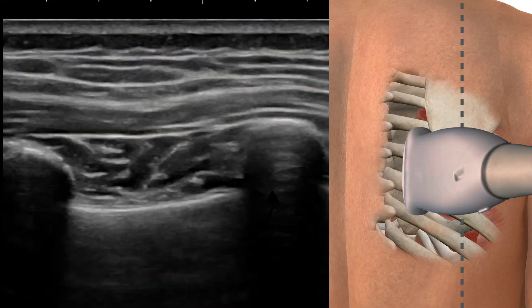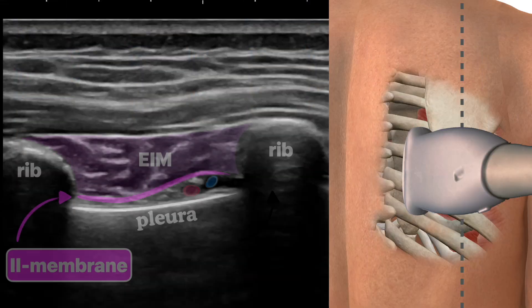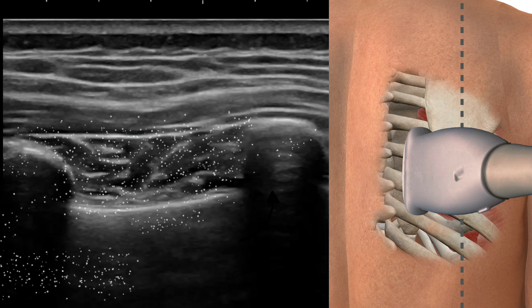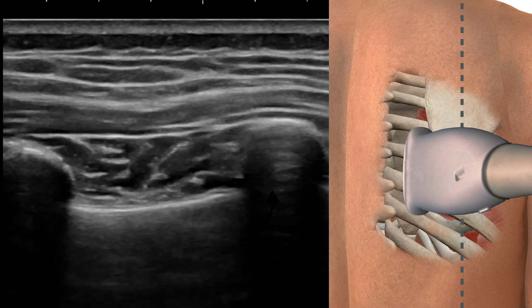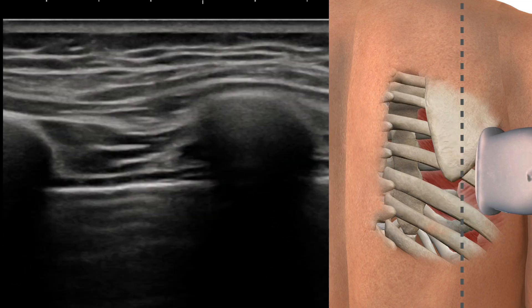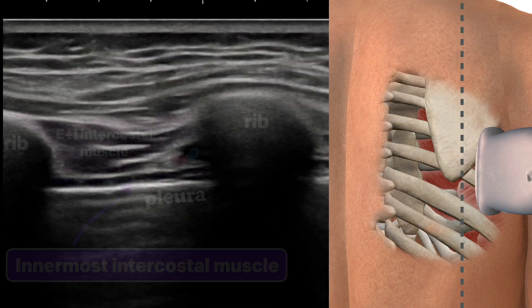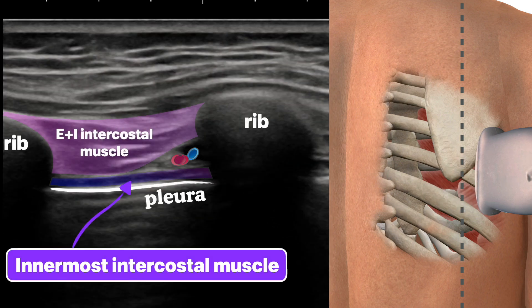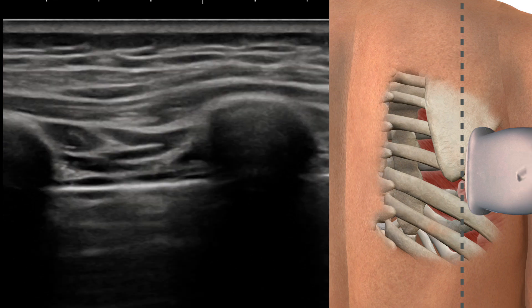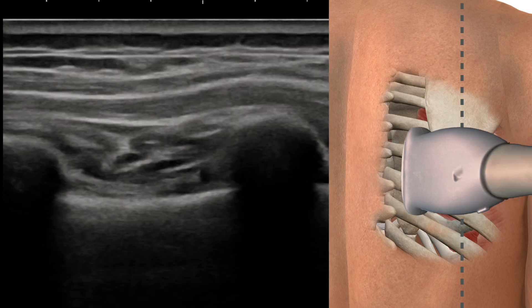We can see this change when we scan the posterior chest wall. In the initial medial view, the neurovascular bundle is adjacent to the pleura — note that we can't say for sure where the nerve is. As we move laterally, we pick up a very thin, dark layer deep to the vessels: this is the innermost intercostal muscle. And as we slide medial again, we lose it.